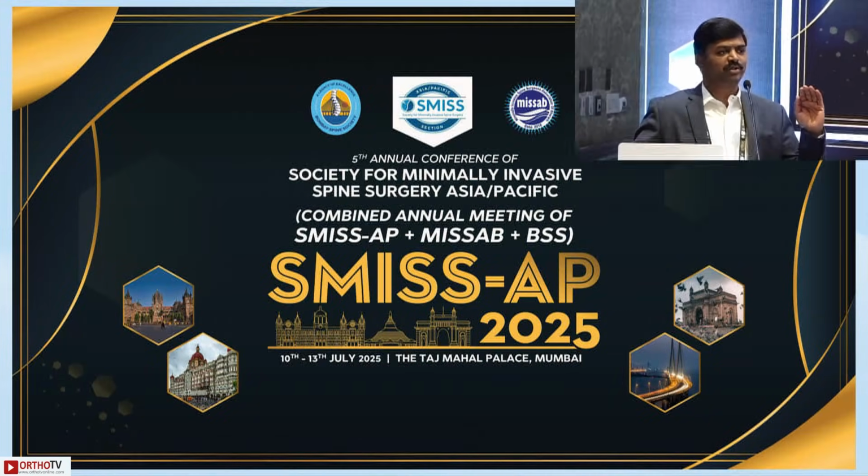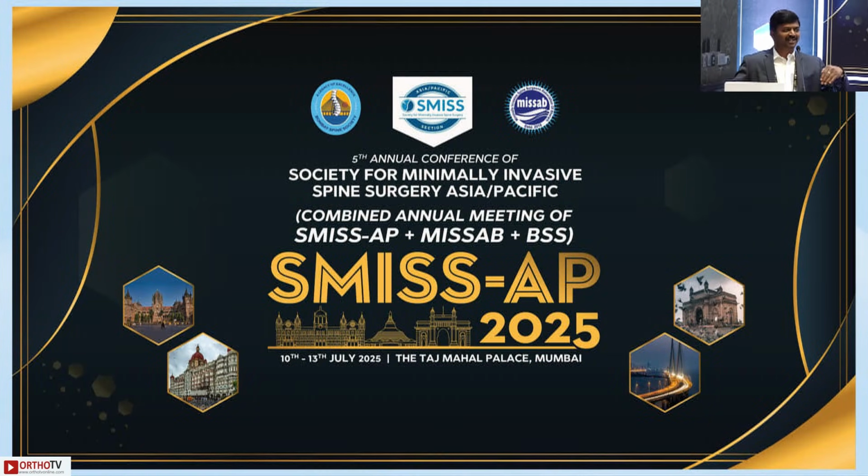And when you are going lateral, you see a thin fibrous tissue going across the nerve. We have seen there that fibrous tissue which goes across the nerve perpendicularly is the level of the vertebral artery. So if you go beyond that, just deeper to it will be the vertebral artery. So when you see that fibrous band, you stop. You don't go lateral. We have a name for that, Sura band.